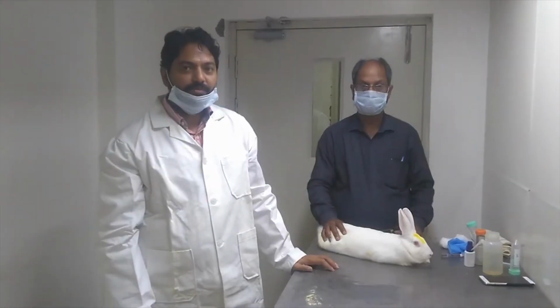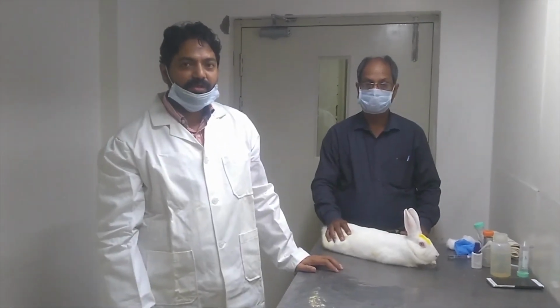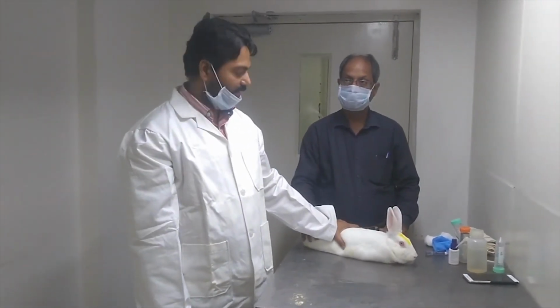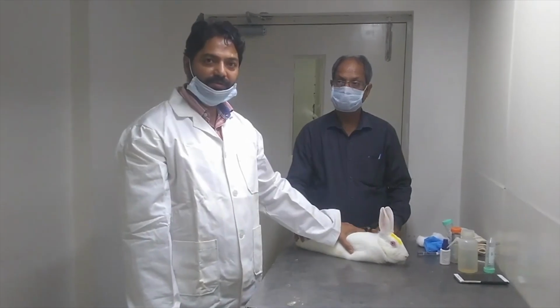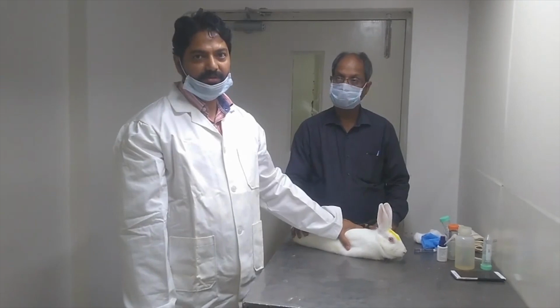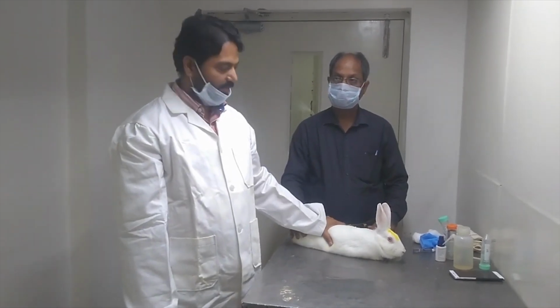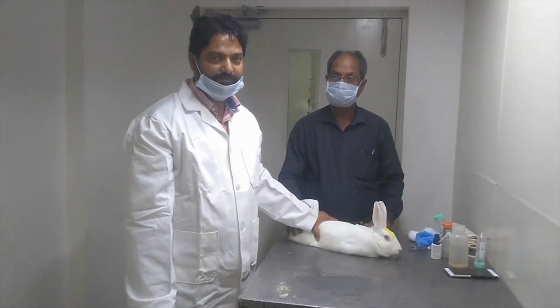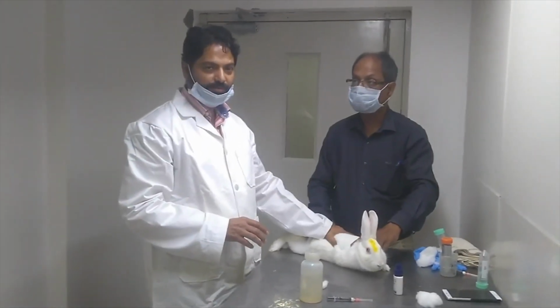So now we have prepared the emulsion. We have come to the animal house. This is our rabbit, which will be immunized. Before immunization, we have to take a pre-immune bleed so that we can compare the serum and the anti-serum later. So now we are preparing to immunize.